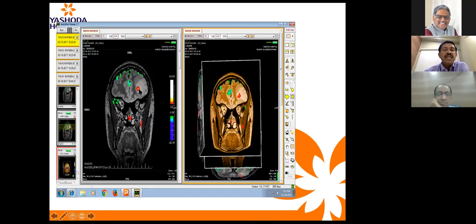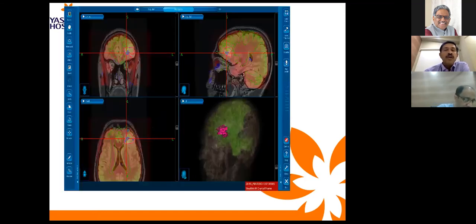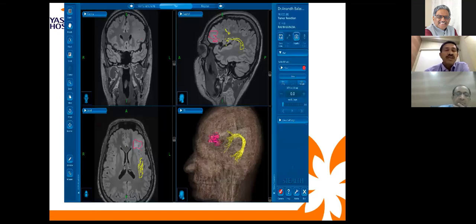And this patient, incidentally, left-sided tumor in the speech area, we found with functional MRI that the speech area is actually displaced downwards. It is in the deeper part of the tumor. So combining navigation, preoperative DTI, and intraoperative monitoring, we could identify the area where the deep part of the eloquent speech cortex is. Preserving that part, we could resect the rest of the tumor.